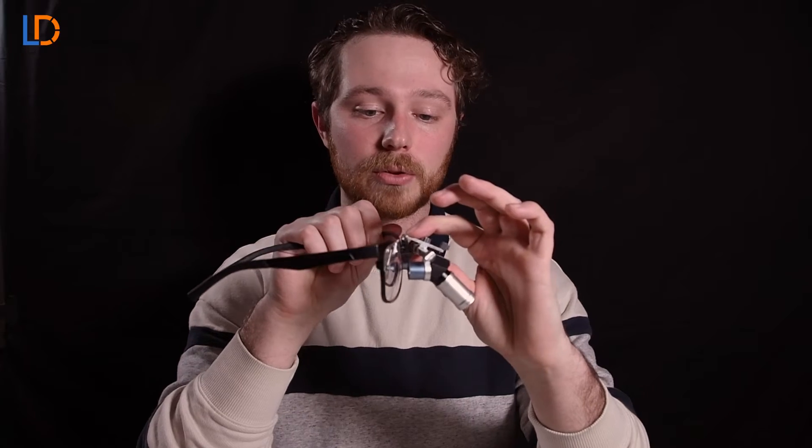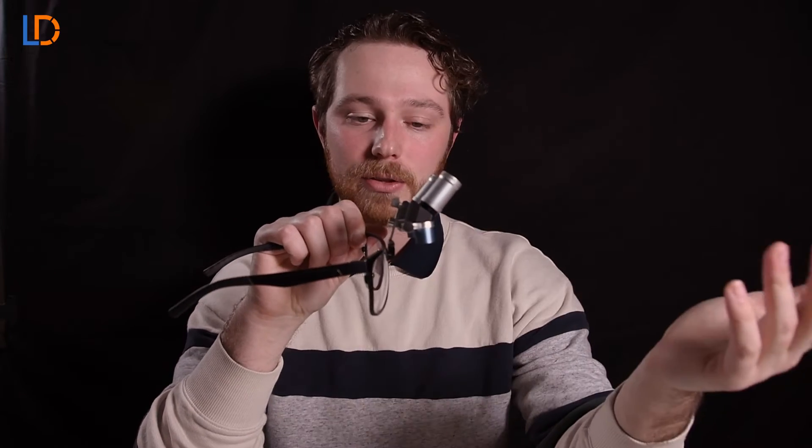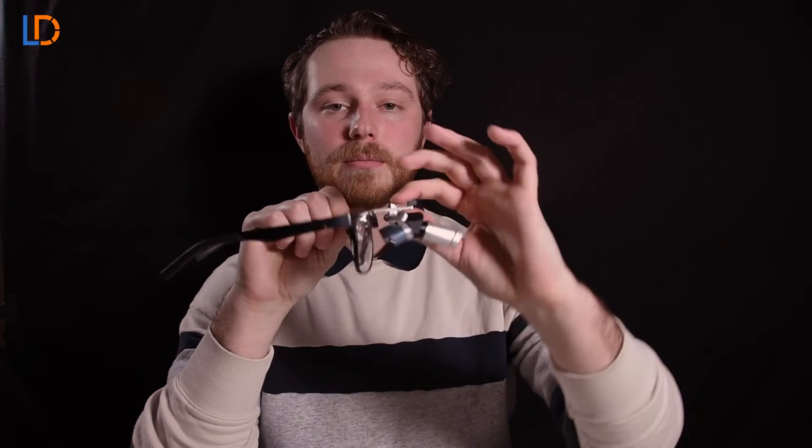And the last thing that you should notice on the frame is this hinge screw. This screw basically tightens the action of flipping the oculars up. So the tighter the screw the harder it is to move.